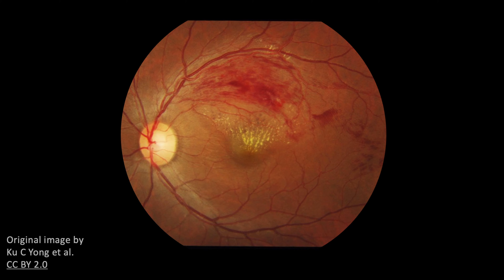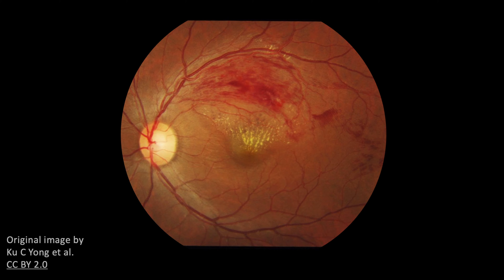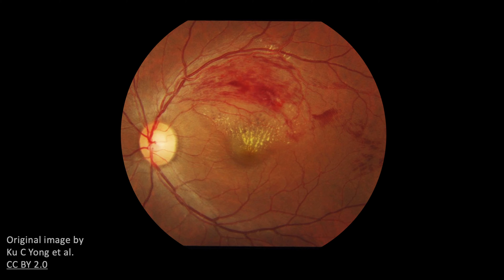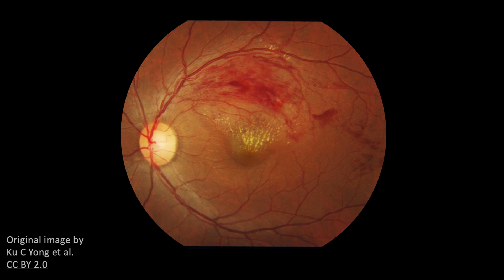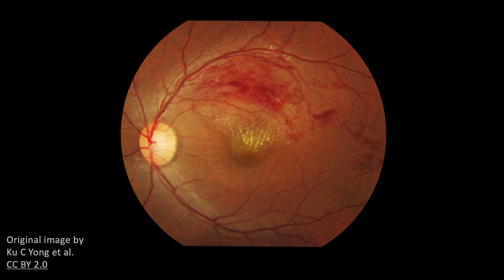There are also hard exudates — that is, yellow-white deposits — due to macular edema. Cotton wool spots are also common with a retinal venous occlusion.